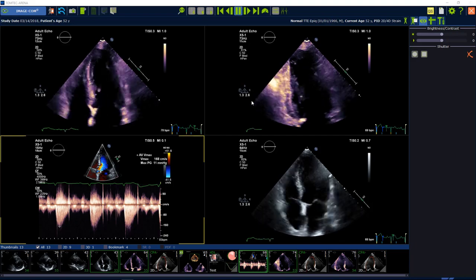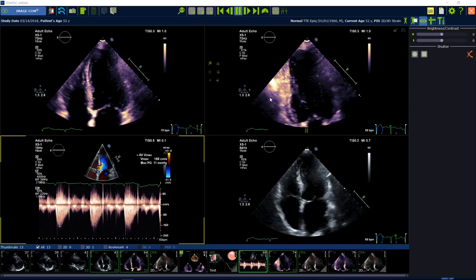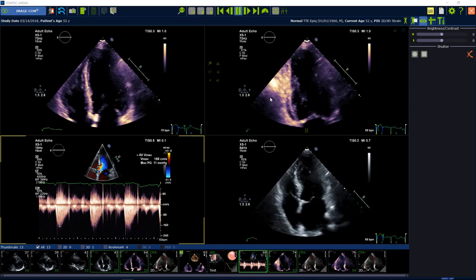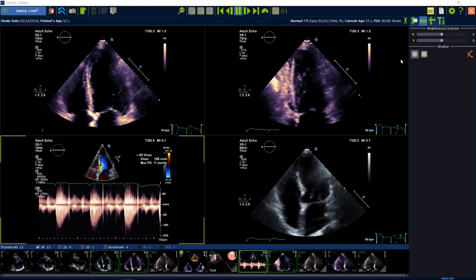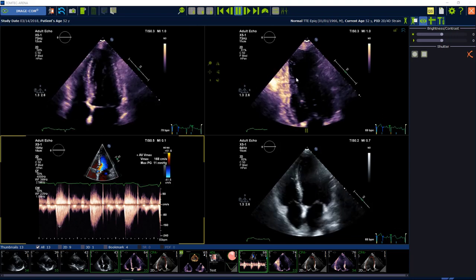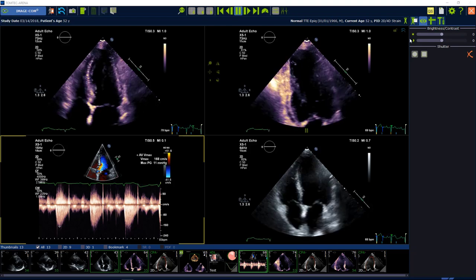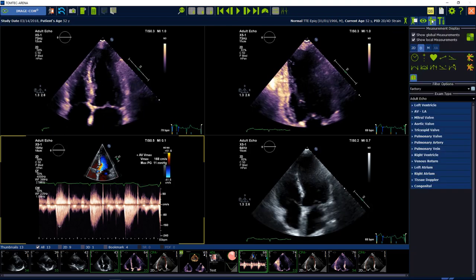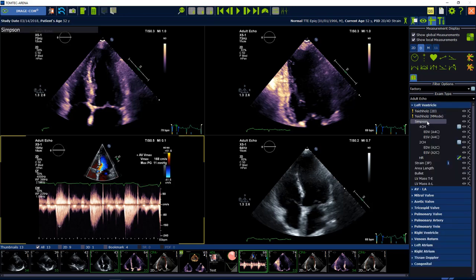Today I want to show you how to perform a quick automated Simpson biplane analysis with our AutoLV software. We start from Image-Com and we need an apical 4-chamber view and an apical 2-chamber view. To start the analysis, please open the measurements package and the left ventricle and there the Simpson package.